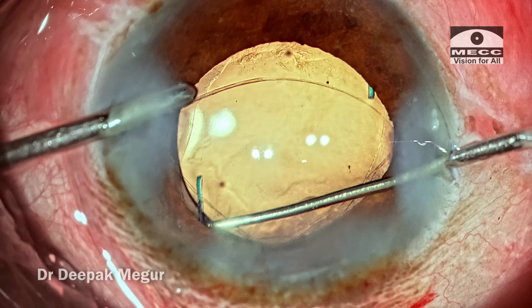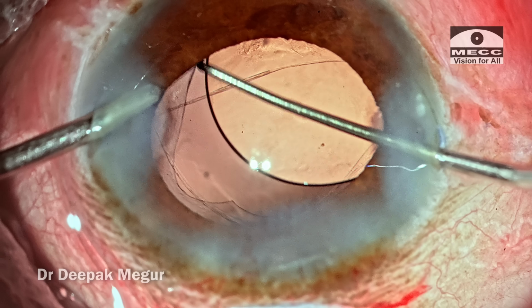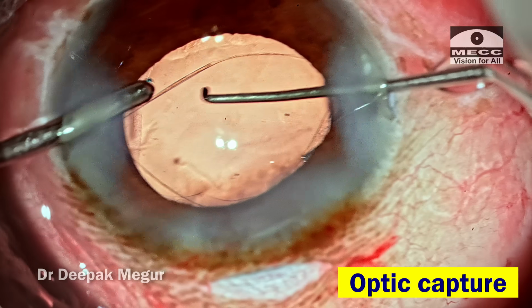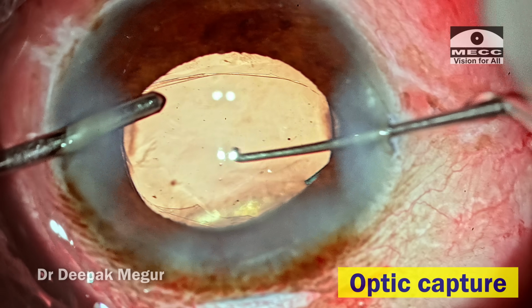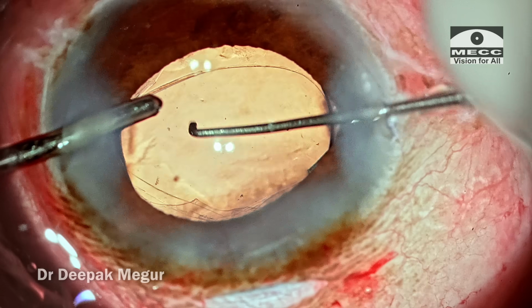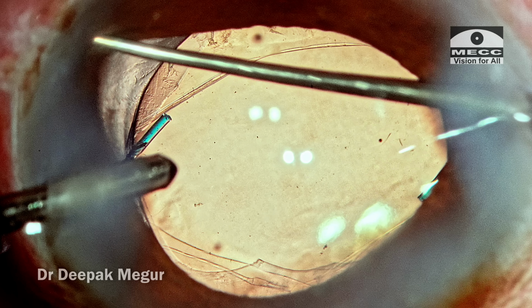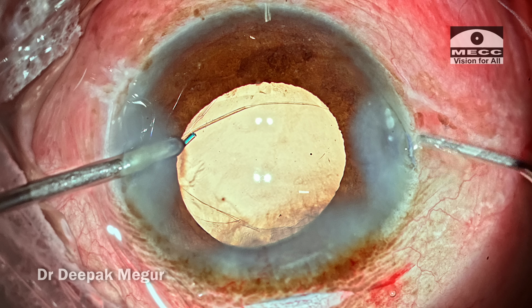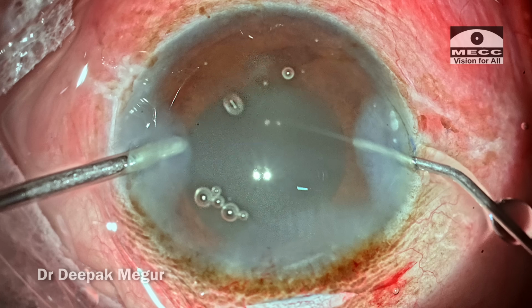The haptics are oriented in such a way that I'm avoiding the longer axis of the rhexis because it is not central and it's not circular. With the haptics now being in an appropriate position, the optic is pushed back to achieve the optic capture. The ovalization of the rhexis suggests that. I'm going to use the Sinskey hook just to confirm that the anterior capsule is above the optic, and this is how it is done.